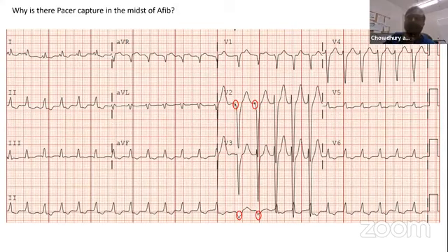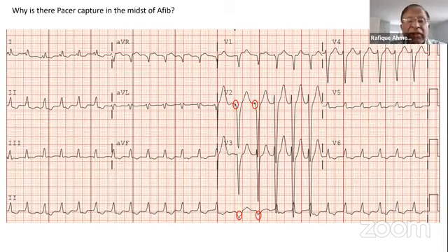Yeah. And is it possible that undersensing of the atrial lead can give you this? So the question is, can undersensing of the atrial lead cause the spikes? Number one, the interval is 480 milliseconds. We don't program the atrial pacing rate that high. It can only happen if it is tracking something. So that is very, very unlikely if it were undersensing.